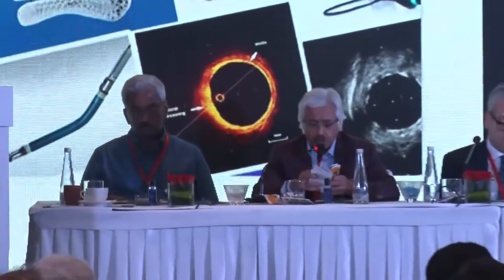Thank you, Praveen. Those were extremely good cases, and truly the correct use of laser, apart from thrombotic lesions as well as uncrossable lesions. I think in-stent restenosis is a great indication. So, Ravinder, I think you have a comment or question? I think great cases, sir. Just one question, sir. Can OCT help us to decide whether you want to use a DEB in an ISR or you want to put another stent?